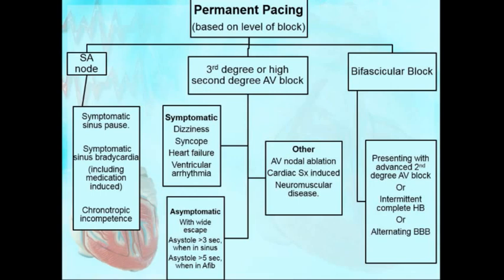But complete heart block EKG recognition is considered a requisite for an internist. So I would want to make sure that the internal medicine doctors can recognize complete heart block. So I can ask an EKG of complete heart block and you recognize it. And usually it ends up in pacemakers. Almost all complete heart blocks get a pacemaker. The indications for not putting a pacemaker in complete heart block would be something that is very reversible.